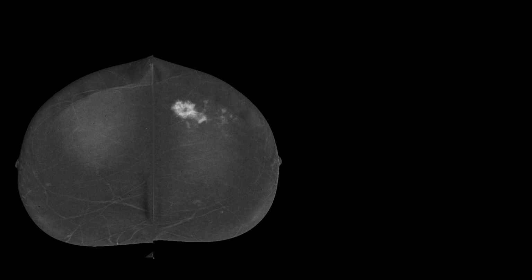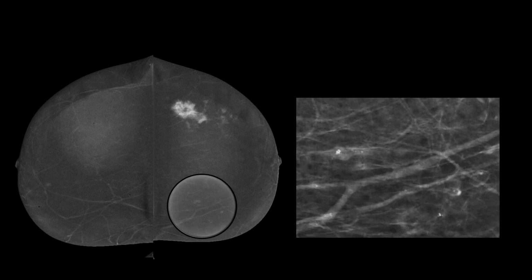This is another example. The patient has this obvious cancer, but look at the medial aspect. There is an area of non-mass enhancement. And it is so much easier with contrast-enhanced mammography because of the low energy view to appreciate that there is a fat-containing lesion, just fat necrosis. We don't need to worry about it. And again, comparison to previous is very helpful.